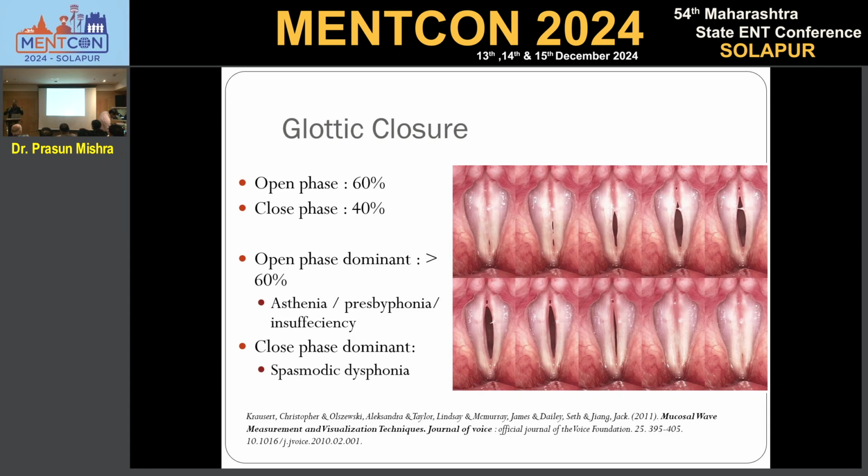So a better way is, instead of you holding the tongue, tell the patient to hold his tongue himself. Because if I hold somebody's tongue, the chance of gag is more. If the patient uses his own hand to hold the tongue, the gag reflex will be less. Secondly, hold the tongue of the patient before putting the scope. Tell him to say e, different phrase. So without putting the scope, let the patient know what is to be done.